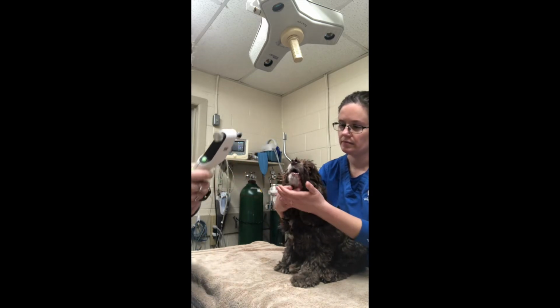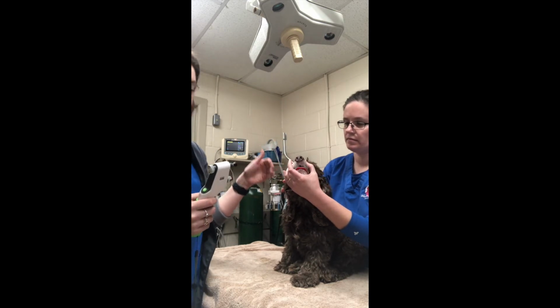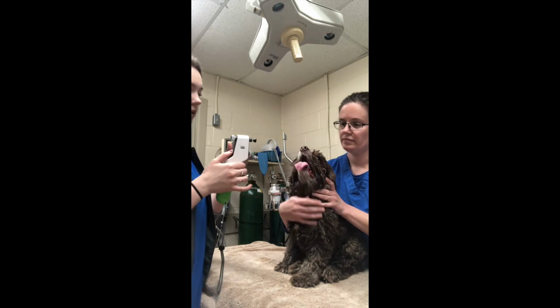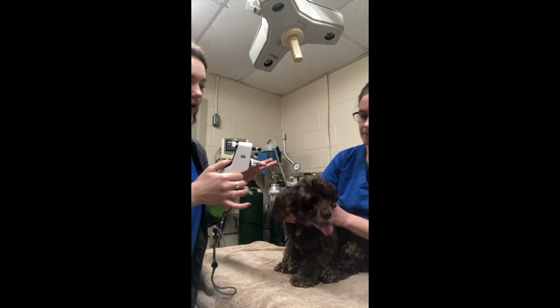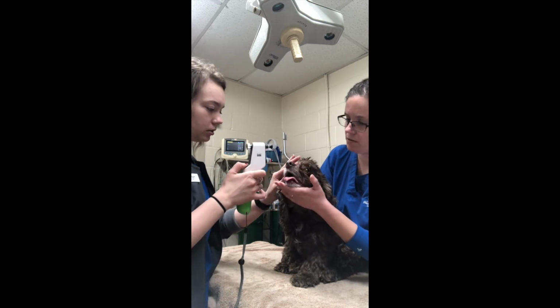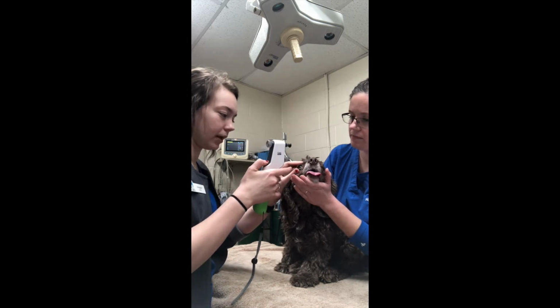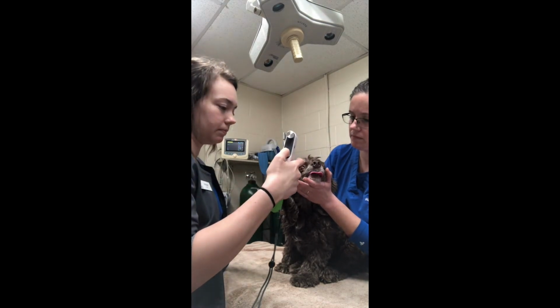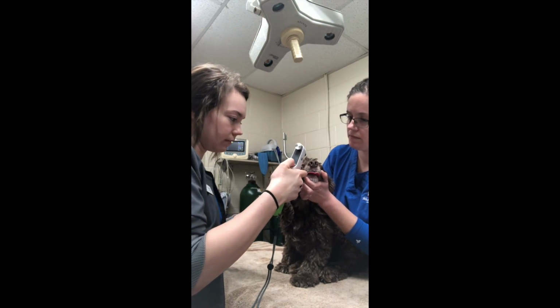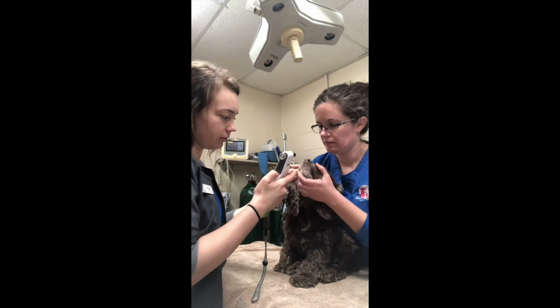And Christina is going to be careful not to apply excess restraint, especially not to put restraint on the neck or around the eyes. When holding this, you want to keep this horizontal and perpendicular to the eye, and this will light up green when it's at the proper angle. So you're going to keep the probe at about 4 to 8 millimeters away from the eye and centering it in the middle of the cornea. And you want to get at least 3 good readings to average them.